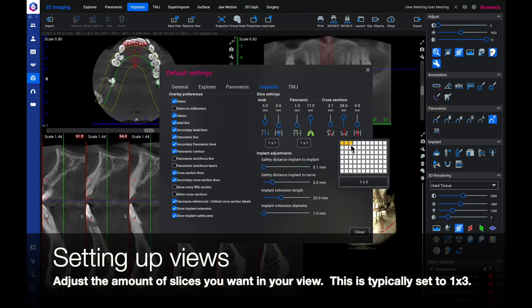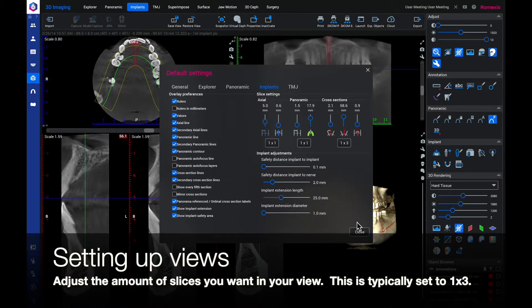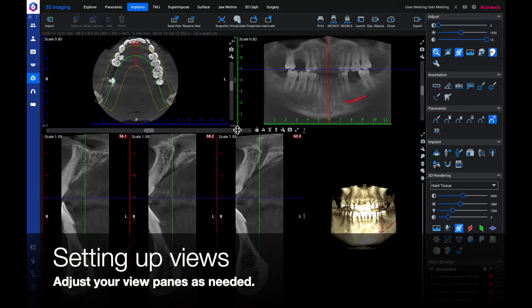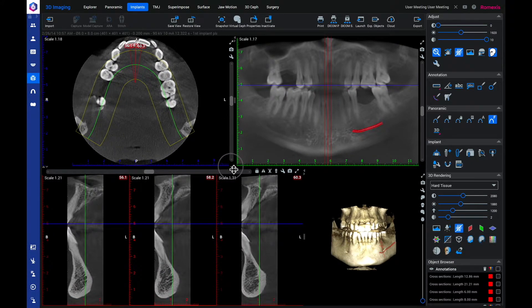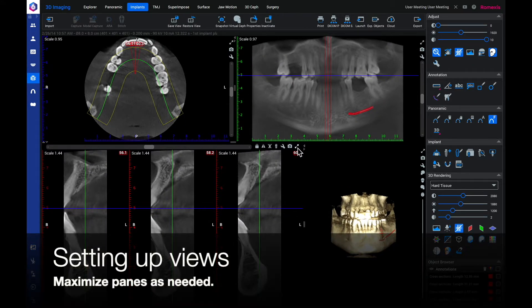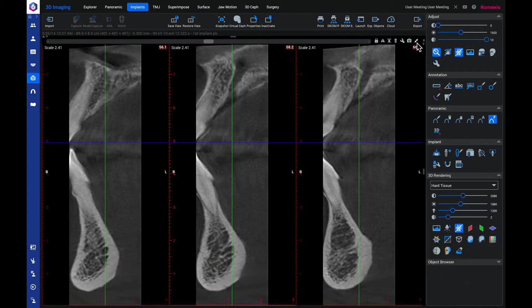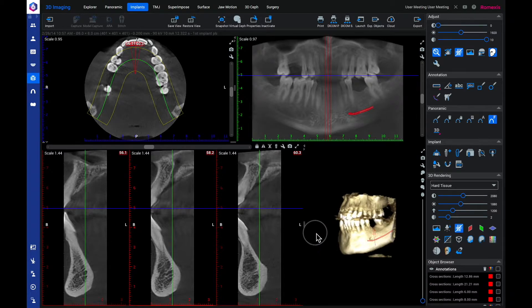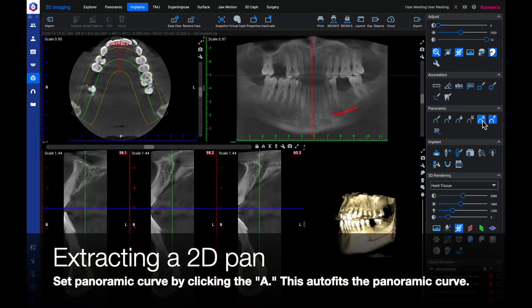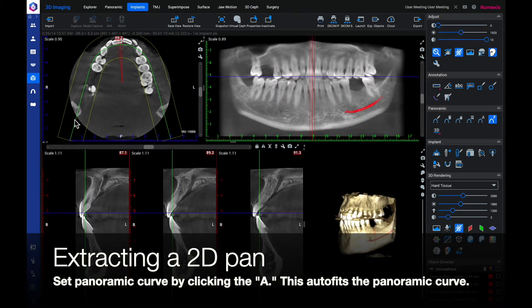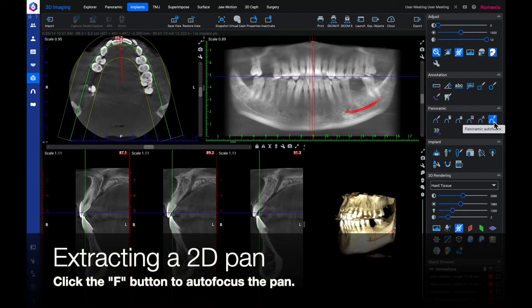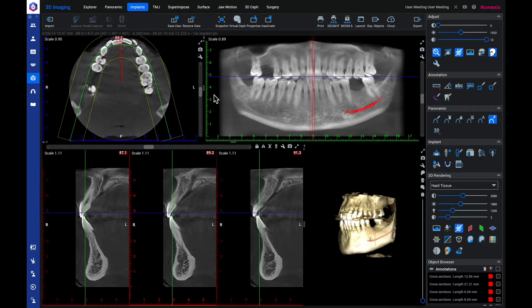Adjust the amount of slices you want in your view — this is typically set to 1 by 3. Adjust your view panes as needed and maximize the panes as needed. It is now time to extract a 2D pan. Set the panoramic curve by clicking the A button, which auto-fits the panoramic curve to the patient. Click the F button to auto-focus the pan to the patient's anatomy.